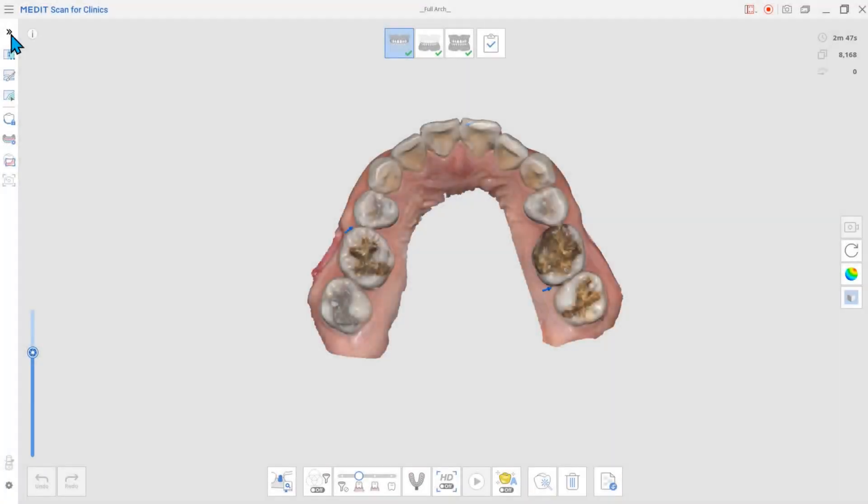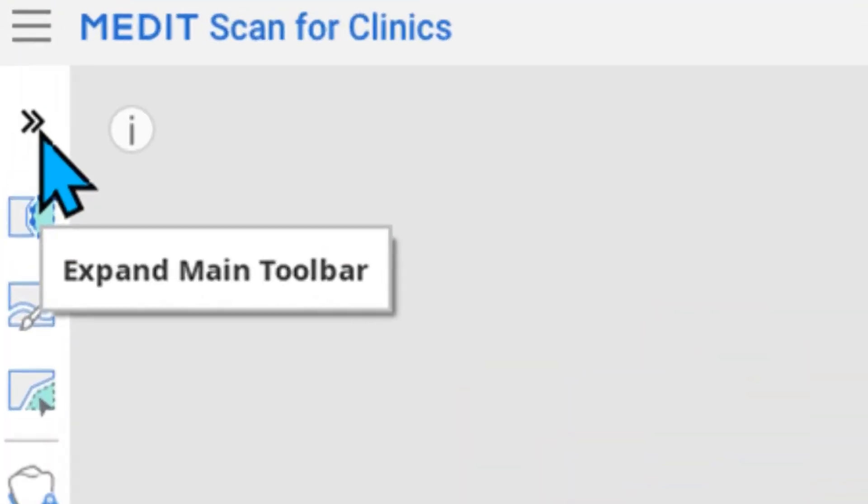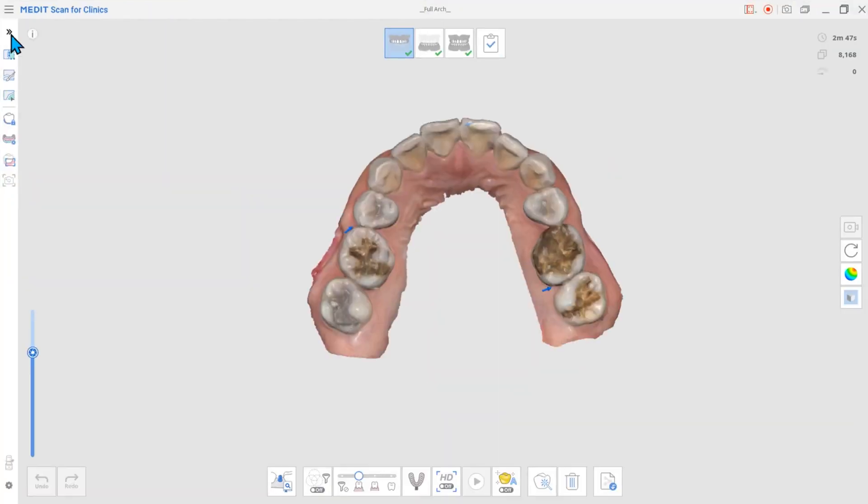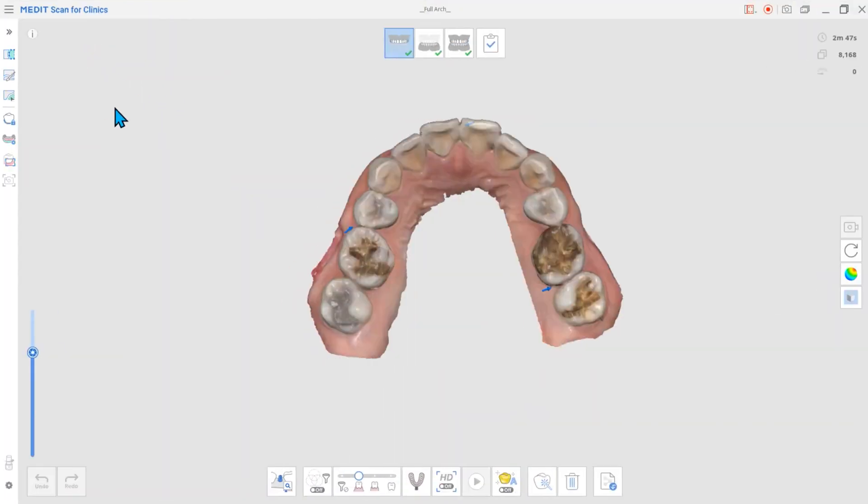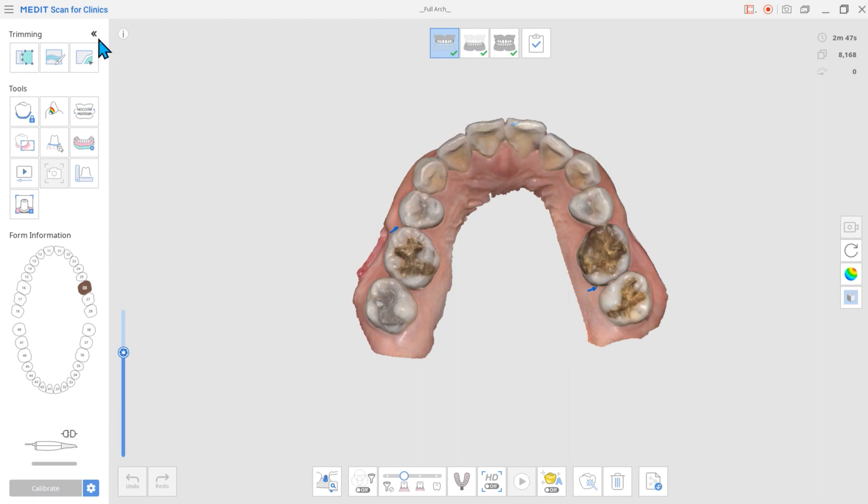We'd like to introduce you to the newly updated Medit Scan for Clinics version 1.7. First, we changed the side toolbox. You can now hide the side toolbox so you can enjoy a wider screen.